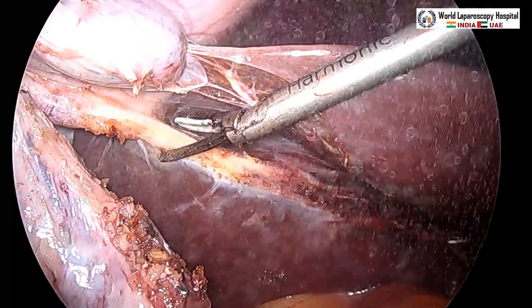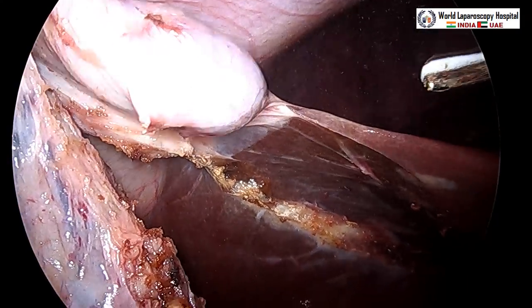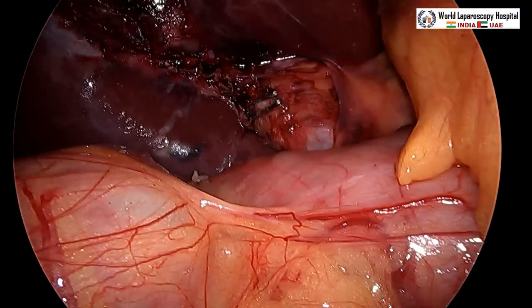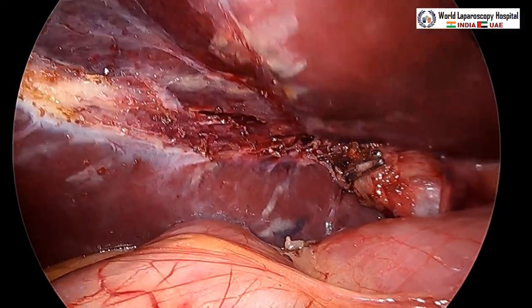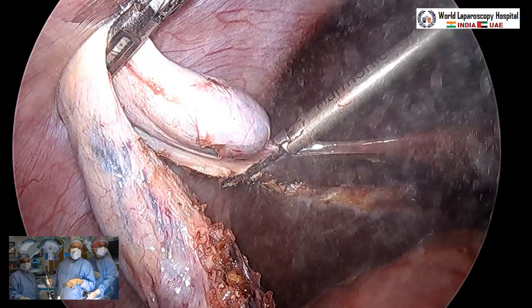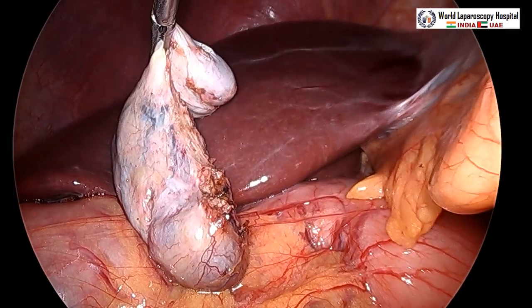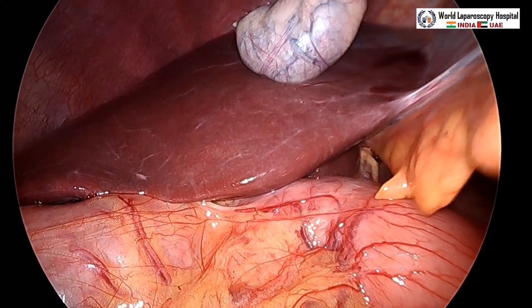With only a small final attachment remaining, before cutting it you should re-examine the cystic pedicle — after detachment your traction will be lost. Go closer and switch on the ICG mode again: the cystic duct, common hepatic duct, and CBD are all visible, with a little dye taken up by the liver. All structures are clearly visible, with no bleeding, no bile leak, no duct of Luschka, and no cystohepatic duct. Then complete the final detachment, hold the neck of the gallbladder with a claw forcep, and extract it via a cannula or endobag.